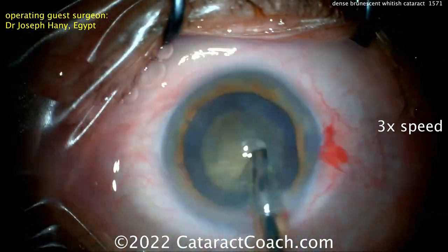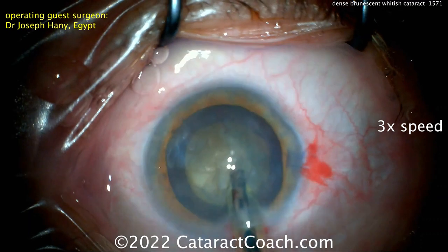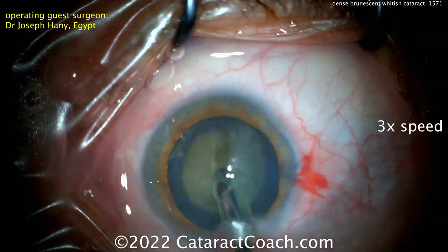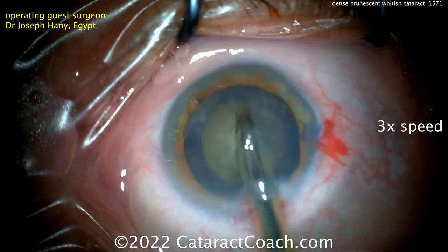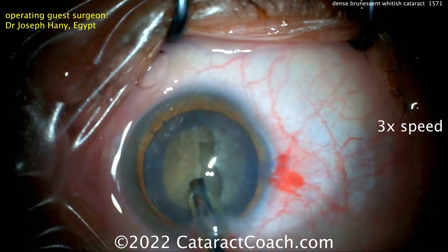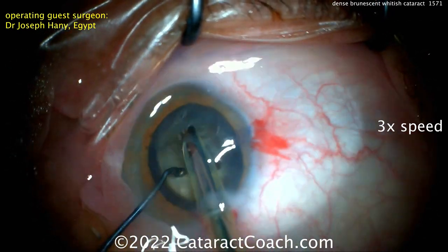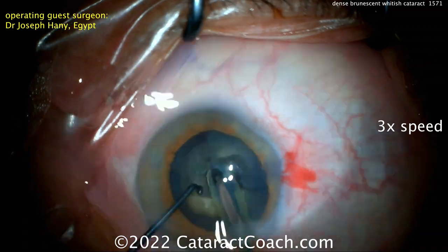A phaco probe going inside the eye, cleaning up some anterior cortex. The technique here is a groove down the middle — a good idea because it's going to de-bulk that dense central endonucleus. The chopper goes inside and splits it — so that looks great. This appears to be a stop-and-chop technique.